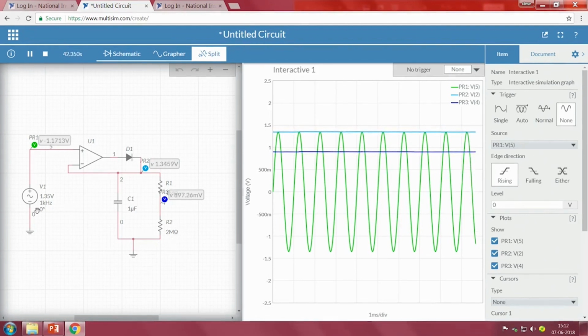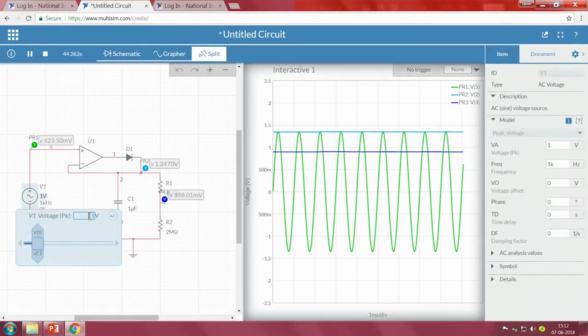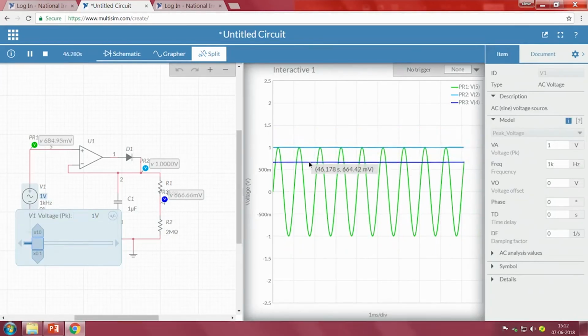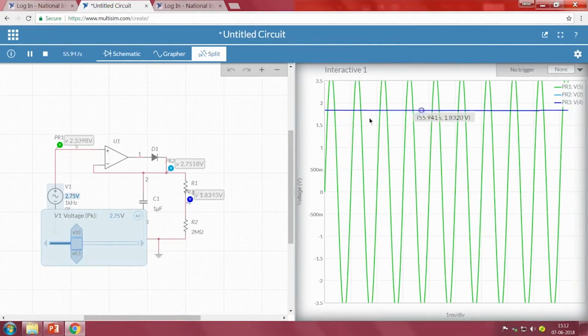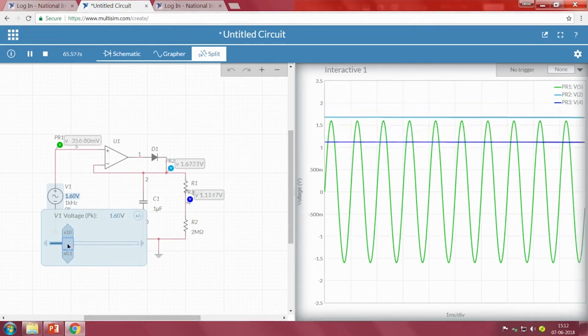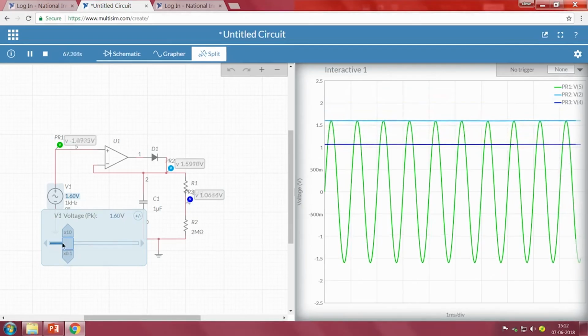Now, to understand that, let me change the input voltage to 1 volt. Now, observe, 664 millivolts. That means it is properly following the threshold point that we set. If the input voltage changes, the threshold value will also change, and how fast it changes depends upon the capacitor value that we have chosen. In this case we have chosen a 1 microfarad capacitor. So, another requirement for the signal conditioning or signal processing circuit of our ECG is completely fulfilled using this circuit.